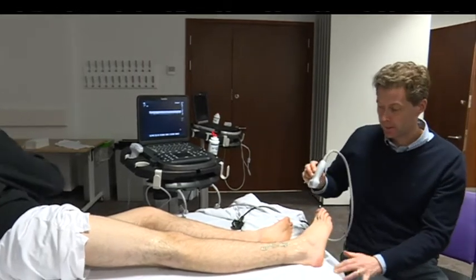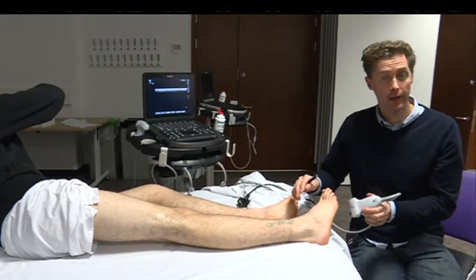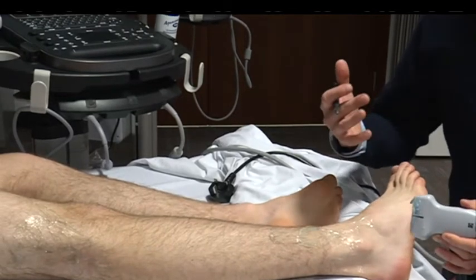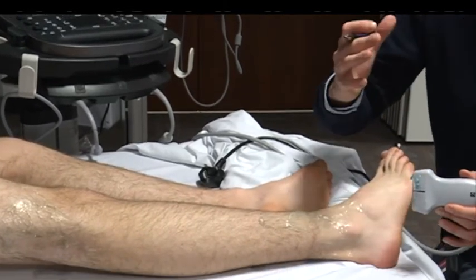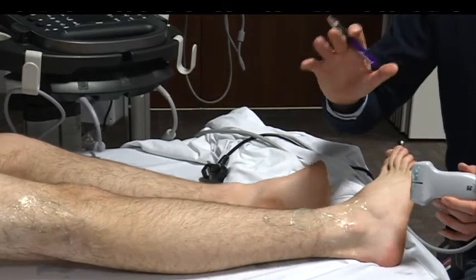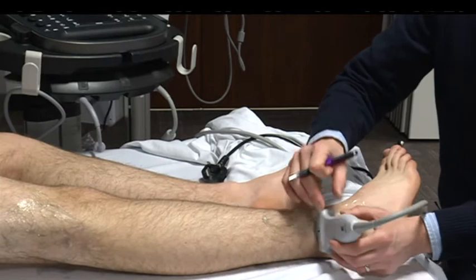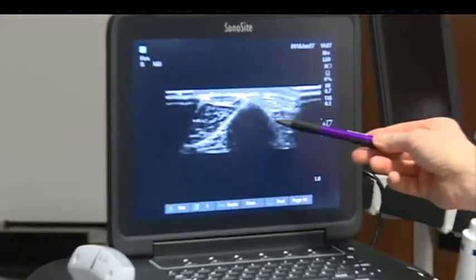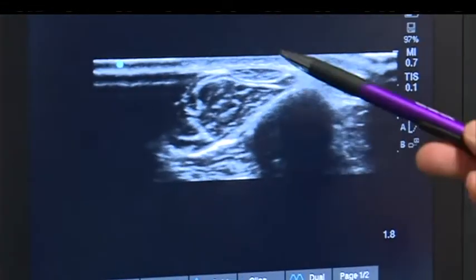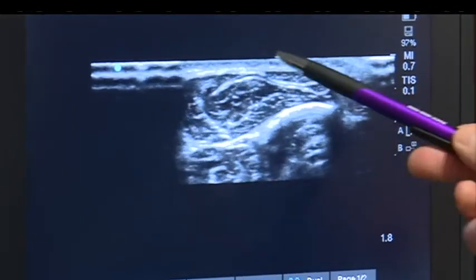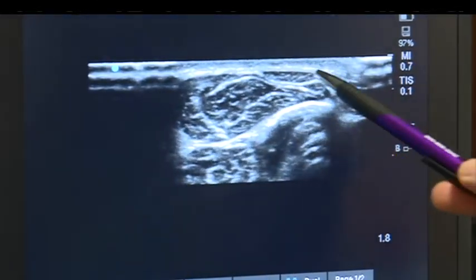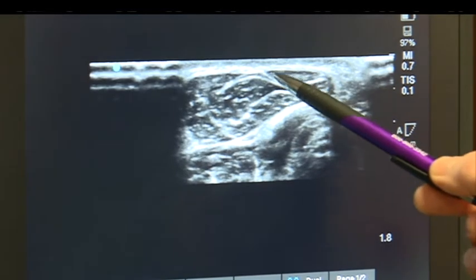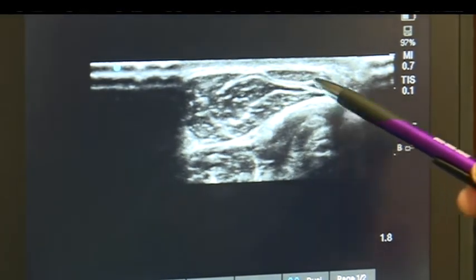Next is the superficial fibular nerve, which supplies the dorsum of the foot. This is the most difficult one because it doesn't have a vascular structure associated with it, so we need to use anatomy to locate it. Starting just proximal to the lateral malleolus, you can see the bony shadow. Posteriorly there are two muscle groups — it sometimes looks like a cycle helmet in cross-section.